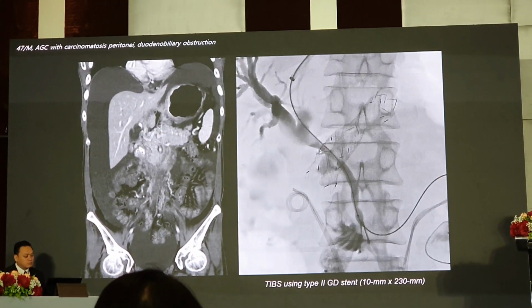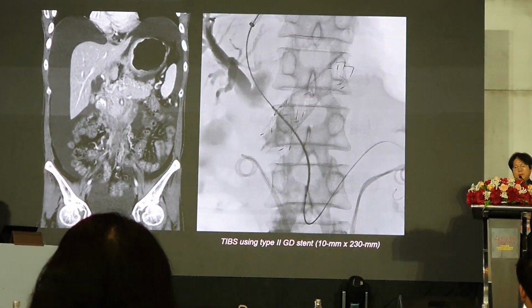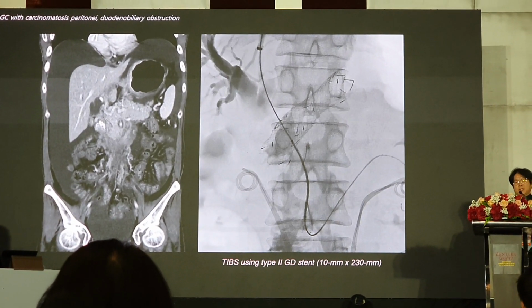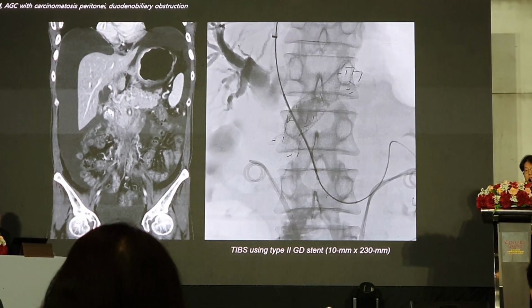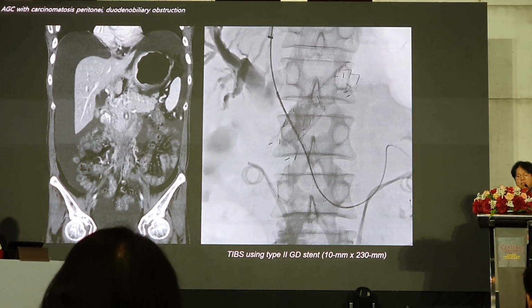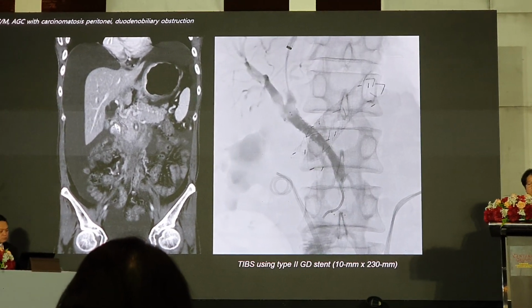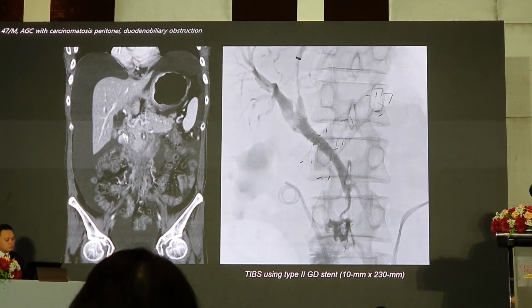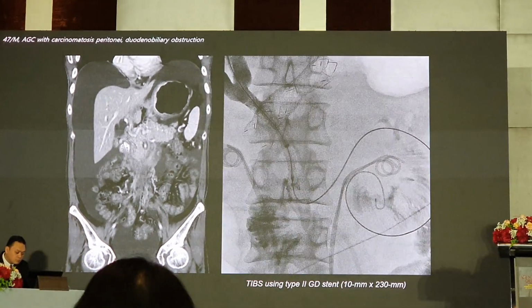At the time, prior to biliary stenting, we performed dilatation, and we initially put a bare metal stent to treat the stricture. I successfully deployed the bare metal stent in the CBD. Cholangiography after the bare metal stent shows poor stent function at the distal CBD, and also you can see the duodenal stricture.